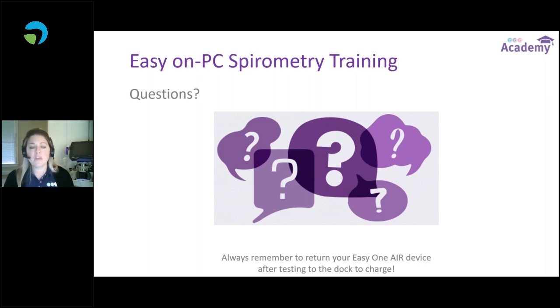But we've just found there's a lot less error on the patient side when they perform the entire maneuver in their mouth. That first deep breath in is not going the correct direction to end the test. The test isn't going to start until that blast out goes through the ultrasound sensor. So that's an excellent question. It will not end the test. The test is not even going to start until it actually sees the air going this way through the device.